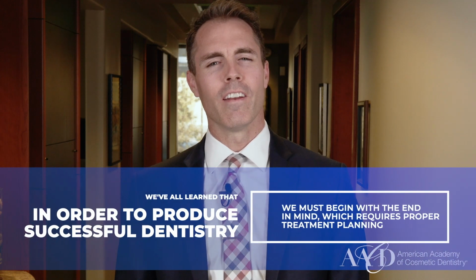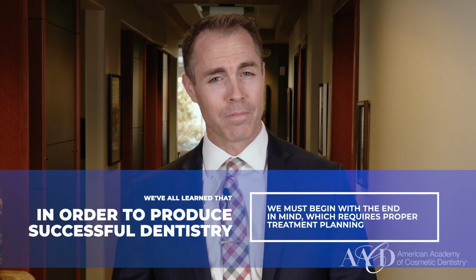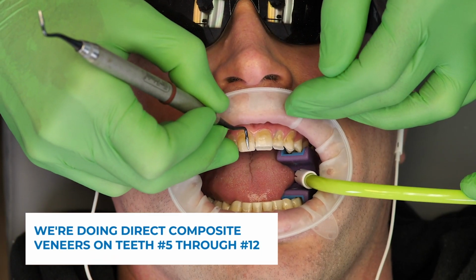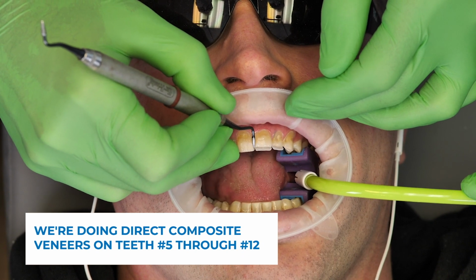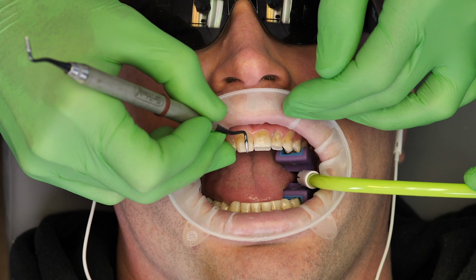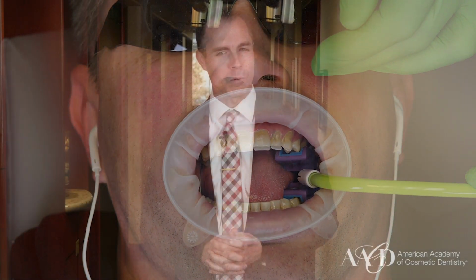We've all learned that in order to produce successful dentistry, we must begin with the end in mind, and that requires proper treatment planning on our part. This is true for a single restoration up to full mouth rehabilitation cases. In today's case, we are doing direct composite veneers on teeth numbers 5 through 12. This is an existing patient of mine of many years who eventually expressed his desire to improve his smile and wanted to know what his options were.